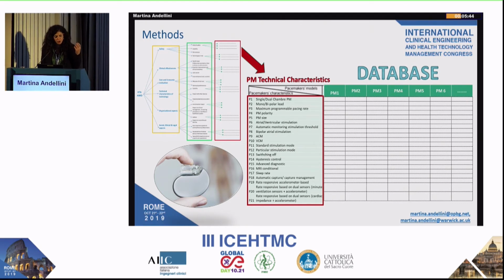Starting from all the key performance indicators defined, we extracted the main pacemaker technical characteristics.